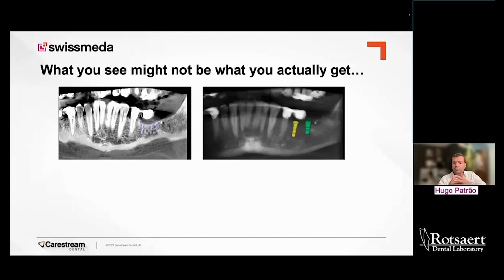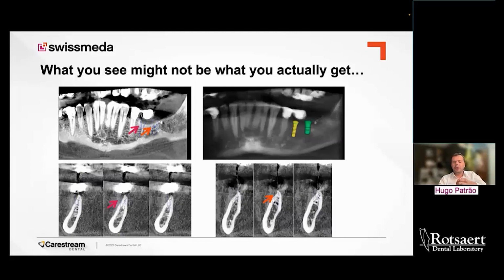And you know what? Those would actually have a problem, because if they are too deep in the bone, then the bone would start to resorb. But let's see, are they really too deep? When you start looking at 3D images instead of 2D images, you realize that in one aspect, the buccal or lingual part, they are really too deep. Yes, it's true. But in another aspect, they are exposed.